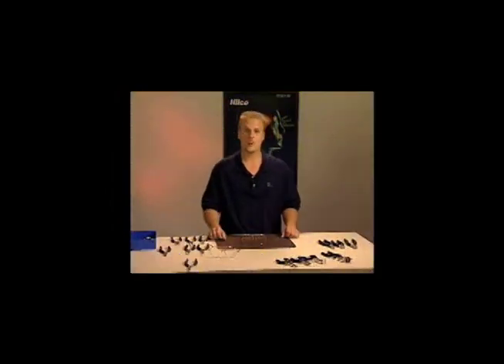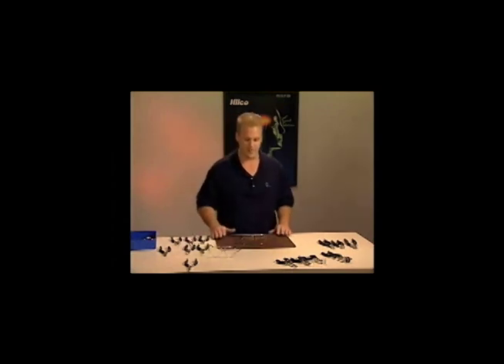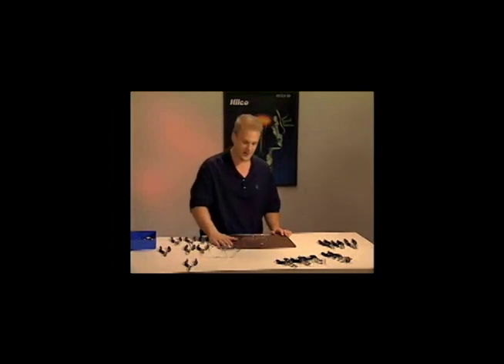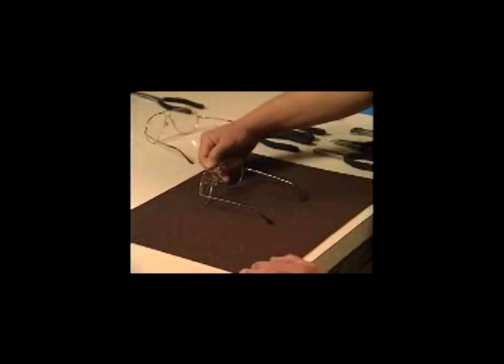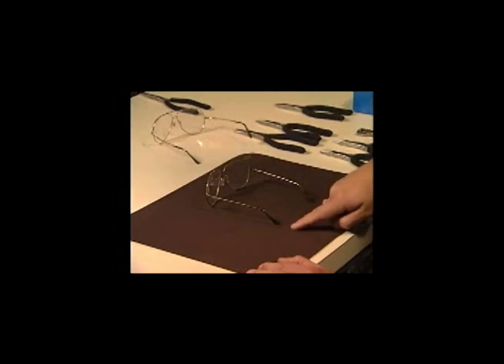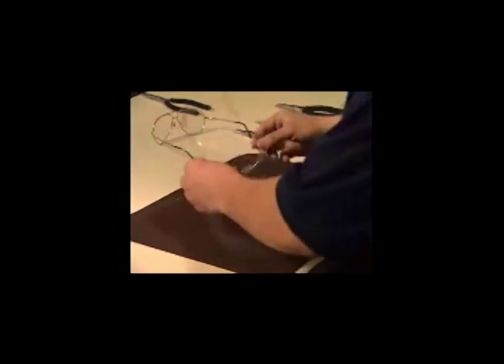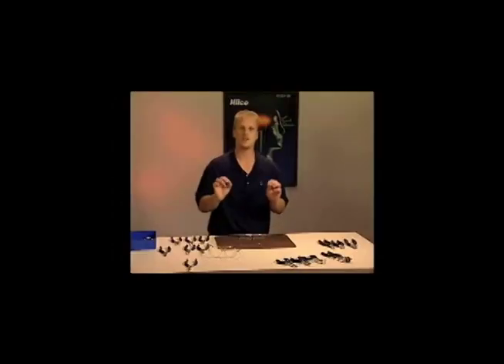Next we're going to talk about four-point alignment, which is a great baseline to use to prep frames for your frame board — or basically before you dispense the frame to the patient and make those final adjustments to fit your patient personally. The four-point alignment has two points of contact on your table mat on the eye wires, and then two points on the temple tips. Some opticians will turn them upside down for a three-point contact, which is just about perfect for the frame board or getting ready to fit your patient.